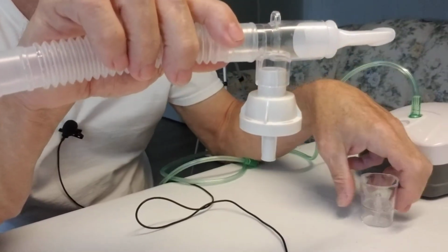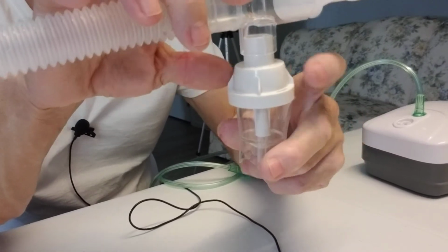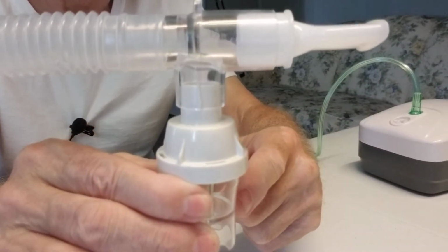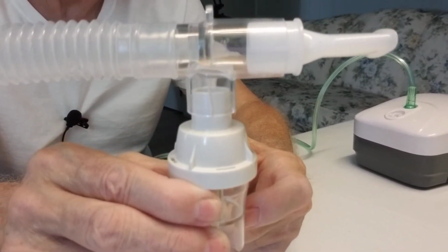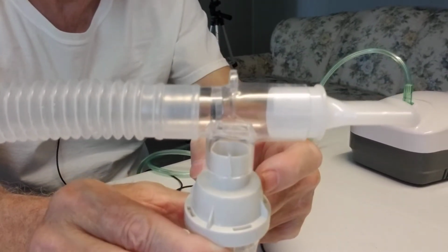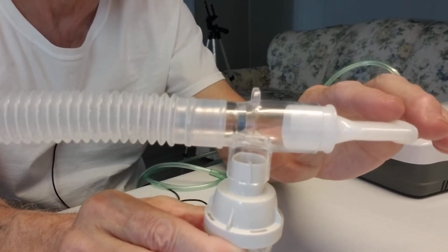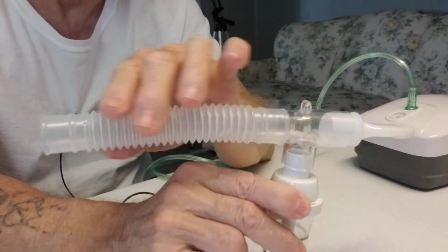The liquid is going to be coming through this, up through this, through here. It's actually going to take this route. The liquid will be down here. The hose will go on the bottom. The hose will force air into here. That will push the vapor from the medication up through this hose, and it will go in both directions. When you breathe in, all of it will go this way. As you stop the breathing process, it will flow out.